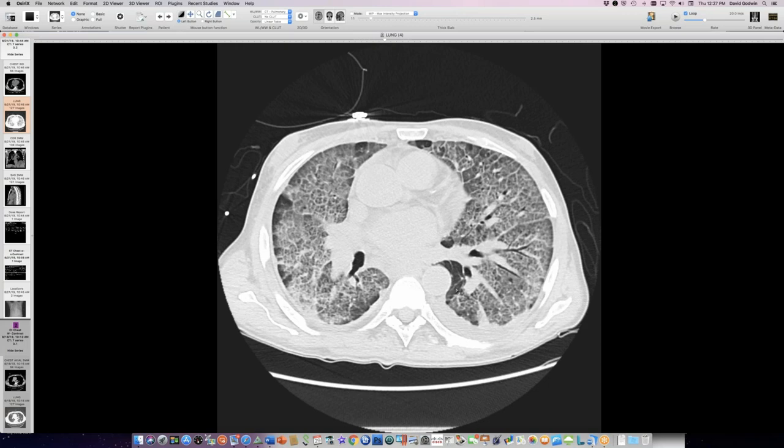Crazy paving: number one, alveolar proteinosis; number two in my experience, Pneumocystis. I've also seen it with sarcoid and with hemorrhage, and sometimes even with other conditions. Those are my cases.